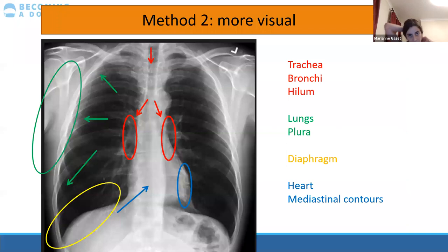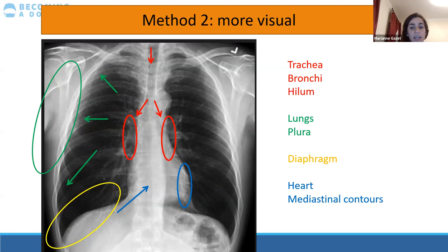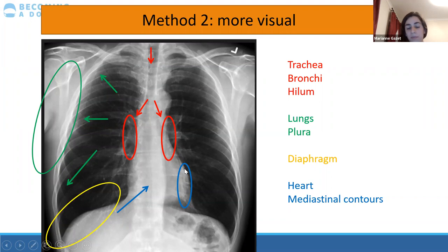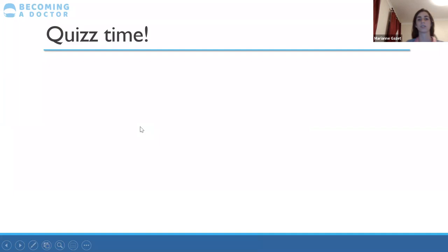Method two for interpretation is a more visual approach — you go on a journey down the lungs. In red: trachea, bronchi, hilum. Then branch out to look at the lungs, then the lung pleura. Then check the diaphragm, and then back up along the edge of the heart to look at the mediastinal contours. For visual people, this is very useful — just imagine walking down the lungs and remembering the different colour-coded categories. At the bottom you can also add everything else: check the shoulders and ribs for any fractures.